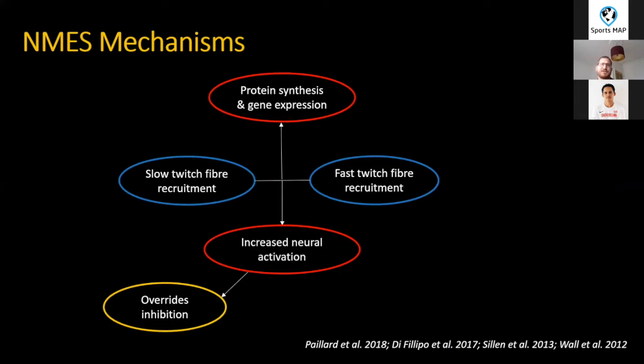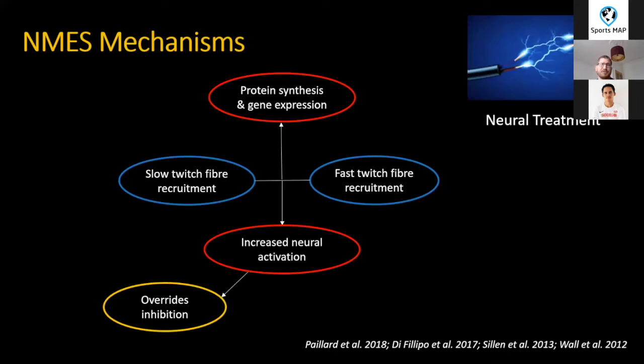And the research shows that increases in strength induced by electrical stim training seem to be mainly mediated by increased neural drive and motor unit recruitment. It's a very neural-based treatment. And the fact that electrical stim and voluntary exercise have different motor unit recruitment effects should be used as a key point motivating the combination of both forms of treatment in terms of neuromuscular rehabilitation.